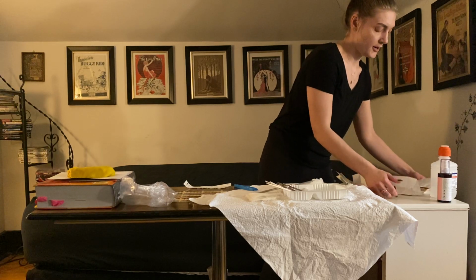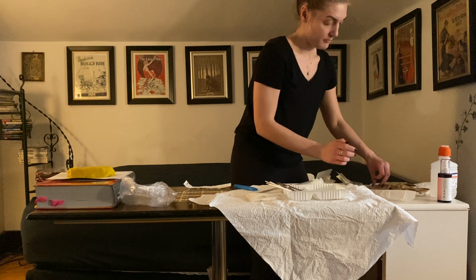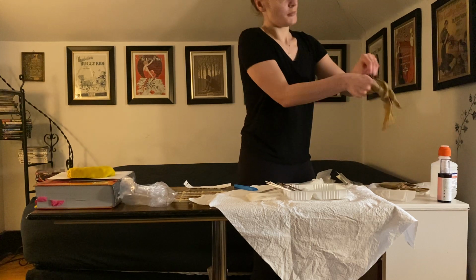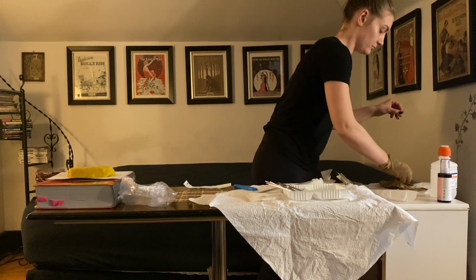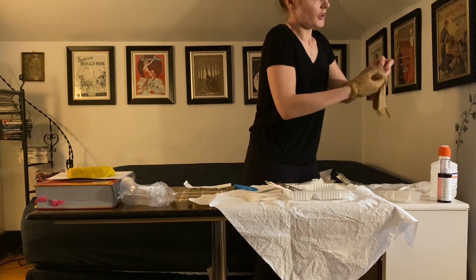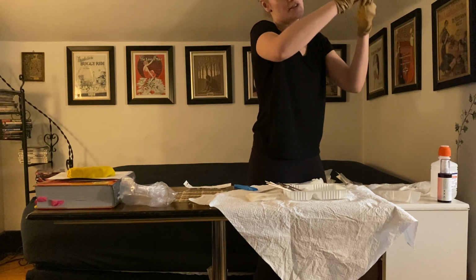So again, being very careful when I put these on. These have been opened a million times as well. Being very careful when I put them on. Okay, so I'm going to irrigate with the 30cc syringe.